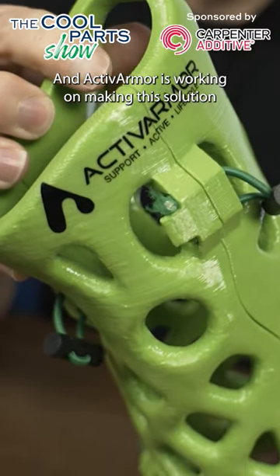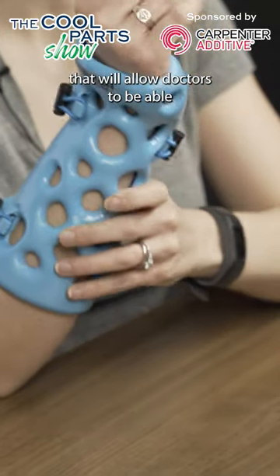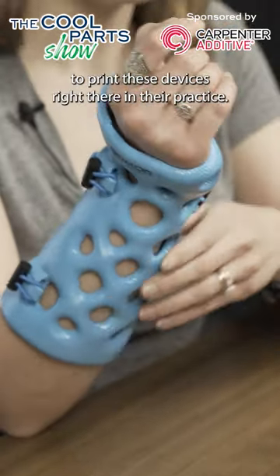ActiveArmor is working on making this solution even more accessible. They're developing a turnkey package that will allow doctors to be able to print these devices right there in their practice.